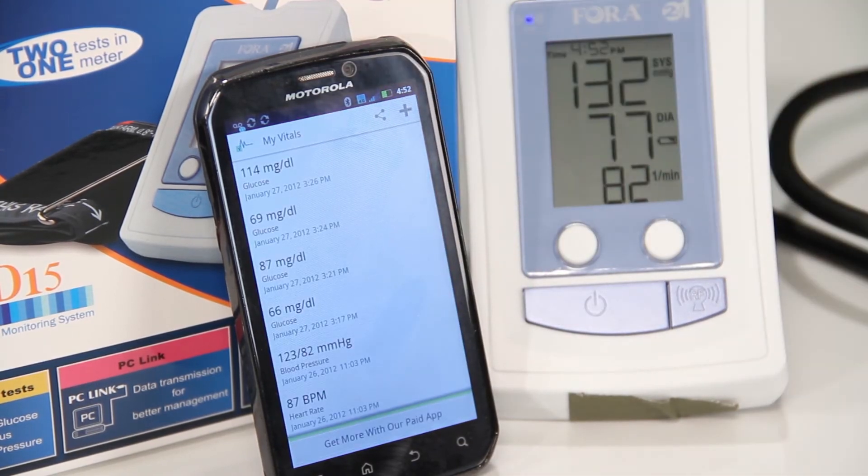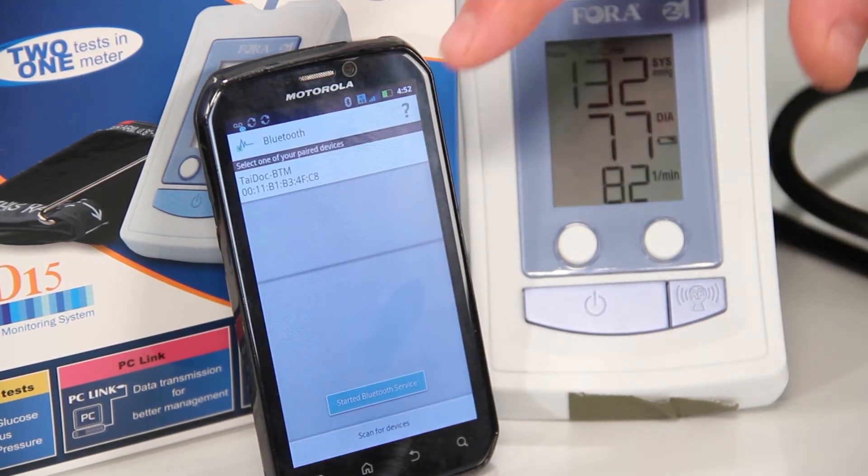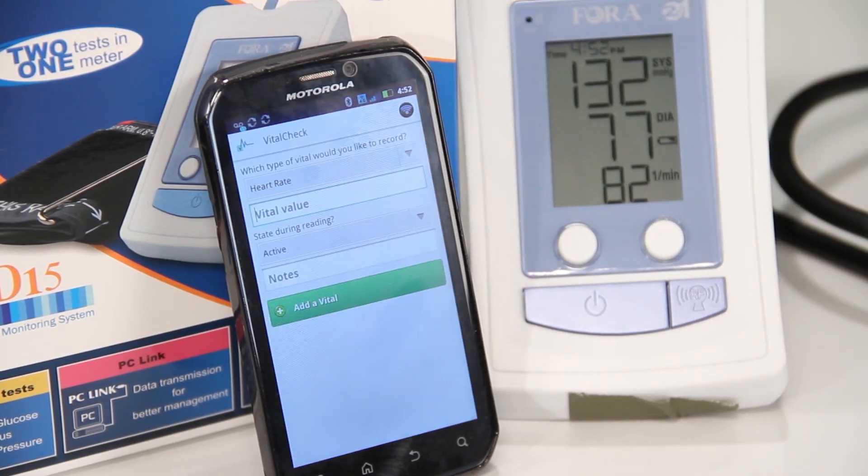Tap on the plus sign to enter the Add Vitals screen. Once the vital sign has been taken, tap on the Bluetooth icon. Tap on the Tidoc BTM to select your device.